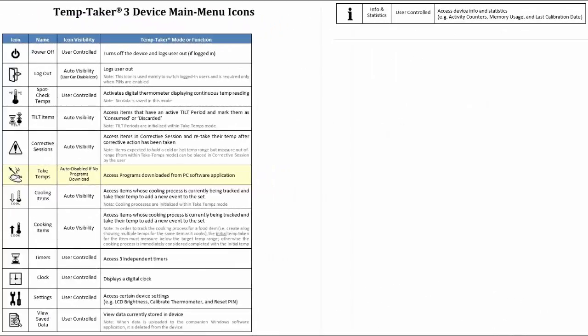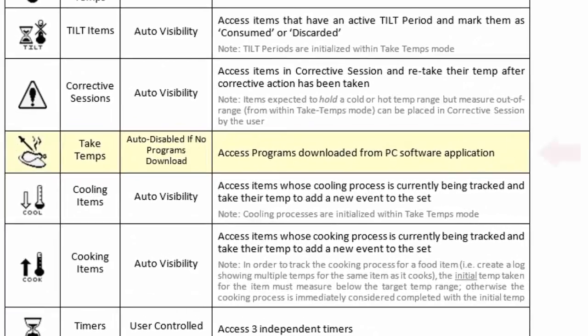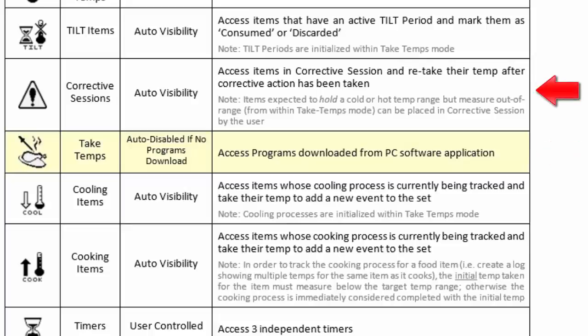These additional icons are as follows. The Take Temps icon is the most widely used icon within the handheld unit. This is where a user will begin any of their temperature or checklist programs they have designed within the software and assigned to this particular handheld unit. The Caution Symbol icon is where a user will go when attempting to re-temp an item that has been placed within a corrective session.